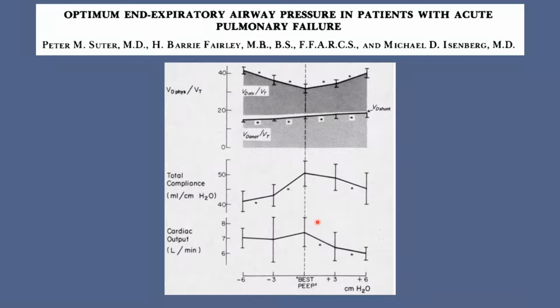But you could see there might be certain cases, especially when you're not sure how reliable the measured compliance is. If you have somebody with really high chest wall elastance or something like that, you may want to think twice about traditional measures and maybe use something like this to be able to determine how much alveolar dead space there is and what you can do to actually modify it. So I think that would probably be the best application at the current time with the knowledge that we have about volumetric capnography for ARDS.